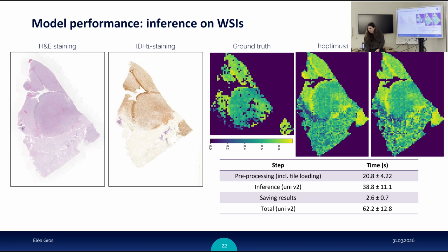And so to recognize on the H&E slide the hypercellular glioblastoma area, to annotate it so that the technician can do the biopsy and do the molecular analysis is not very difficult.